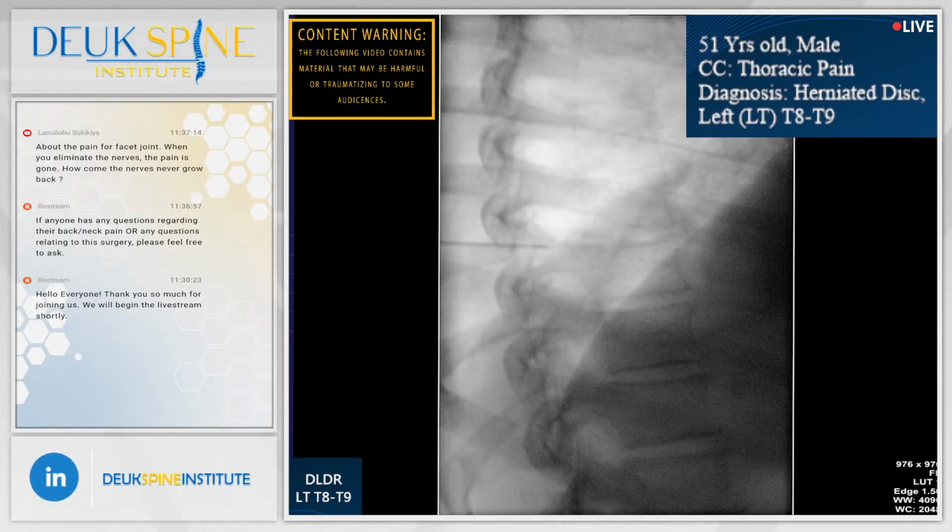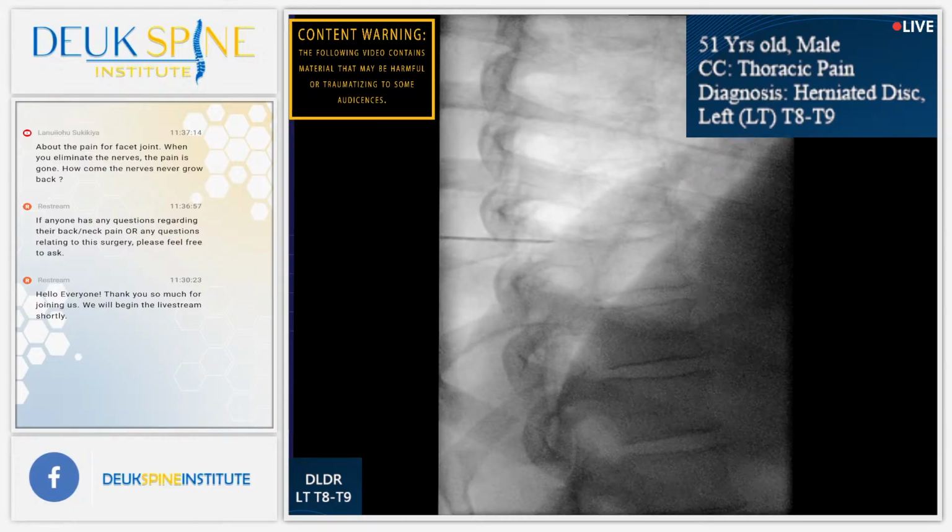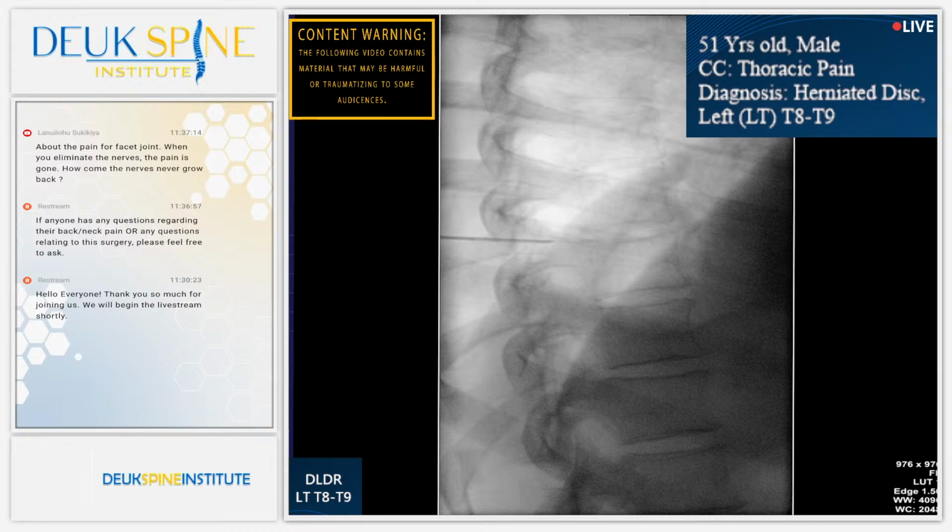Okay, I'm encountering something here. I think it's the transverse process. I may need to be a little bit higher. So I can't seem to get around it. Shot? I need to be a little bit higher. That's the problem.